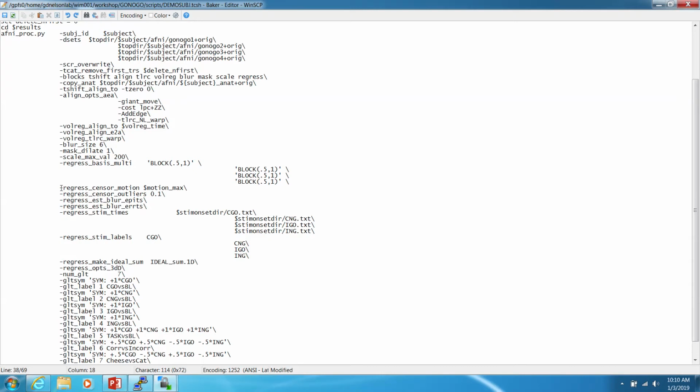One thing when we're running our regressions is that we want to make sure that if there's a lot of movement, we don't include things that have so much movement that the voxel we say we're talking about doesn't correspond to it. Motion's a big problem in running functional scans. People need to be as still as possible. Otherwise, when we say this voxel is related to this, but they've moved 5 millimeters, this voxel here is now this voxel here. So we're very careful about that.